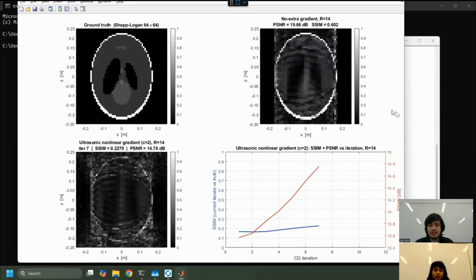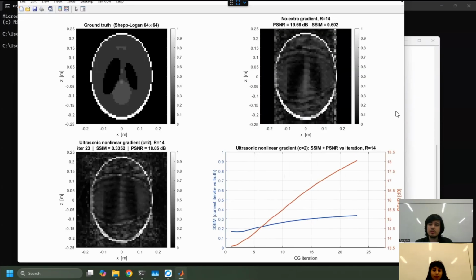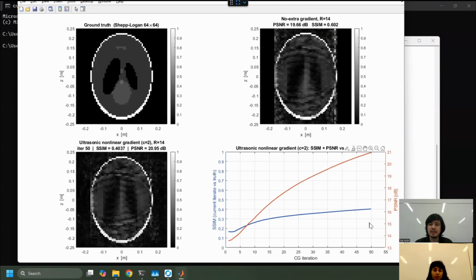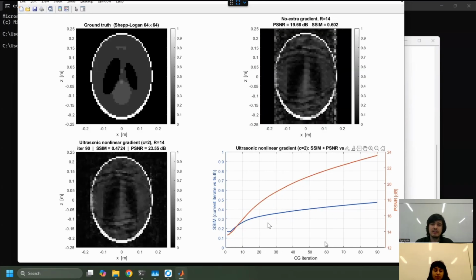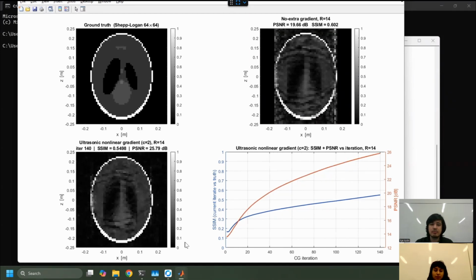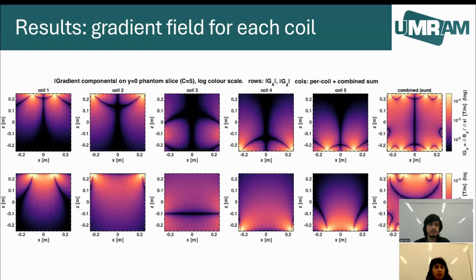Okay, so all of these are running on the GPU because the iterations take a lot of parallel compute, and it takes a lot of time on CPU, and it needs a lot of iterations. Like I said, it needs about 4,000 iterations to optimally converge, but you will see that it converges approximately. So, the optimized conditions for coils: we make this optimization for a different number of coils and find that 5 coils gives us the highest rank for the forward matrix in our optimization problem.